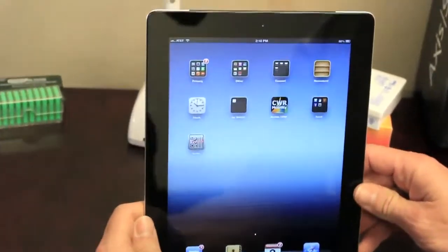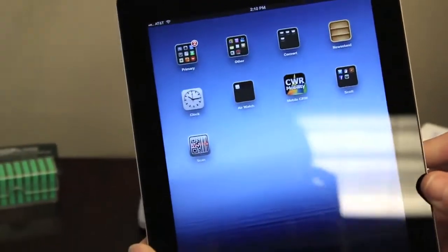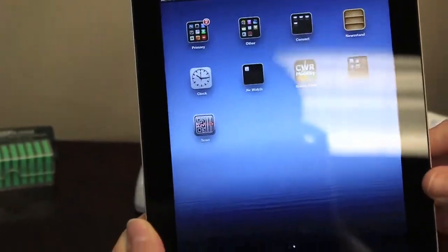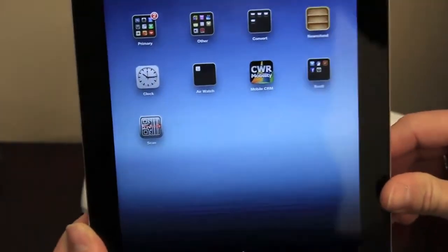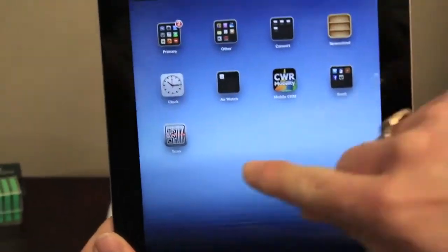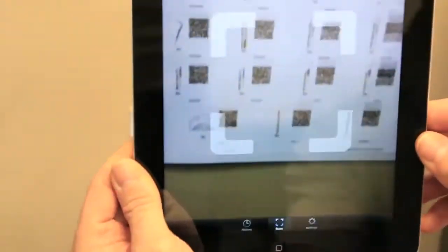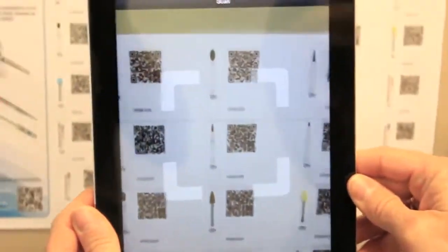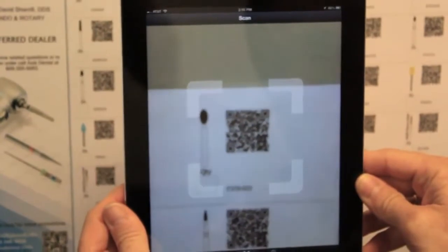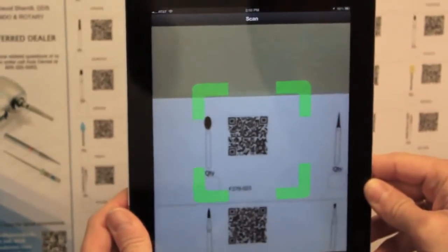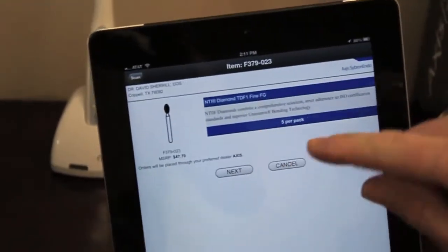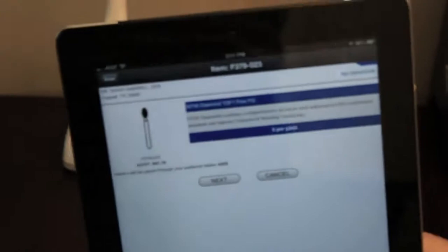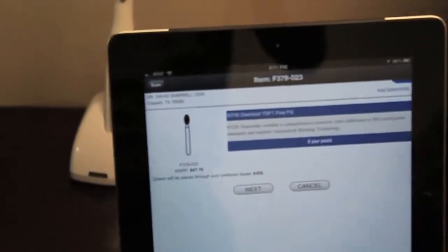So I'm going to scan this one on my iPad. It's also usable on an iPhone, Android, or other types of tablets. I'm going to open my scanner app, pick the item I wish to scan, verify the item, and click Next.